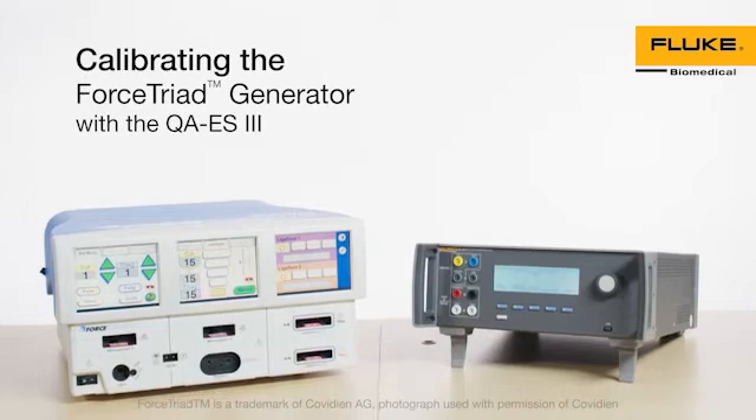Forced Triad Energy Platform Preventive Calibration with QAES-3. This video demonstrates how to perform calibration on the Forced Triad Energy Platform using the Fluke Biomedical QAES-3 Electrosurgical Analyzer.